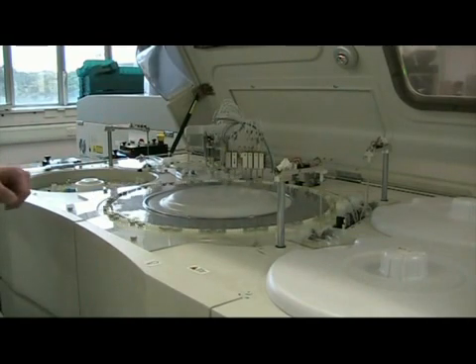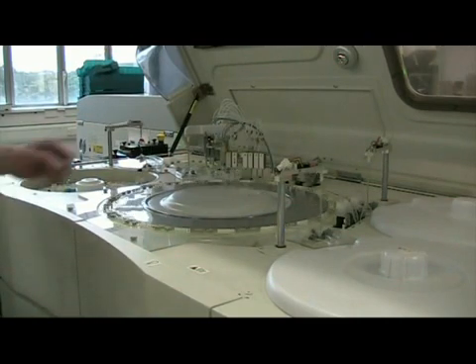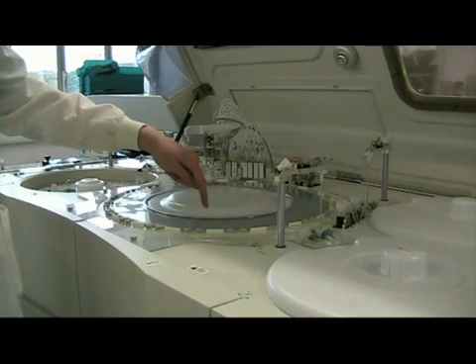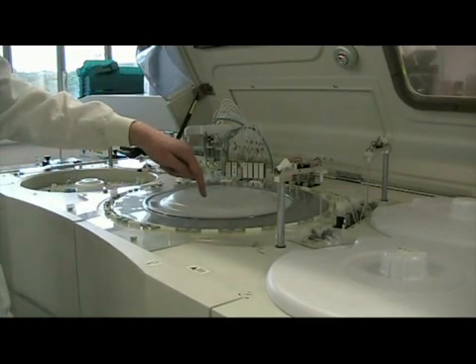Constantly throughout the 10 minutes that the assay takes, the lamp here has a spectrophotometer on the other side inside the ring, which will constantly be taking absorbance readings.